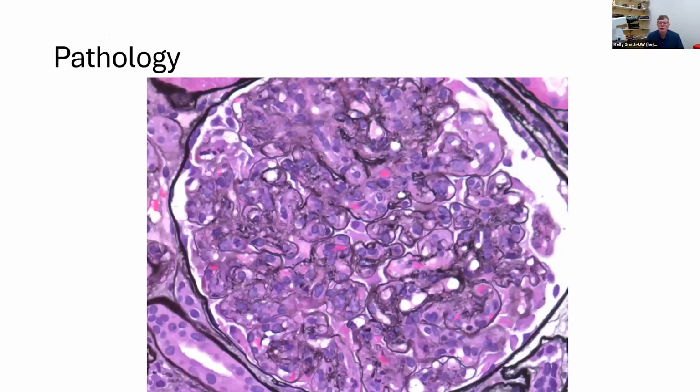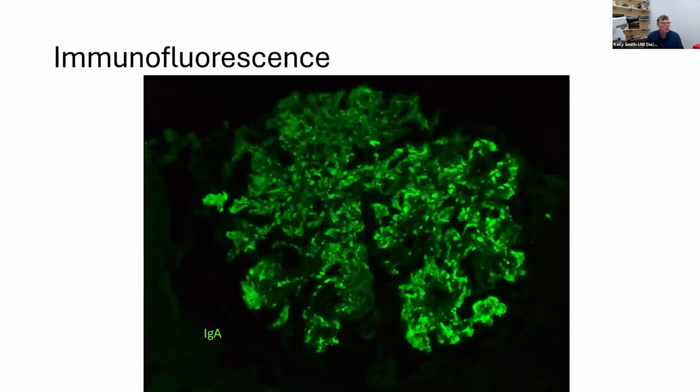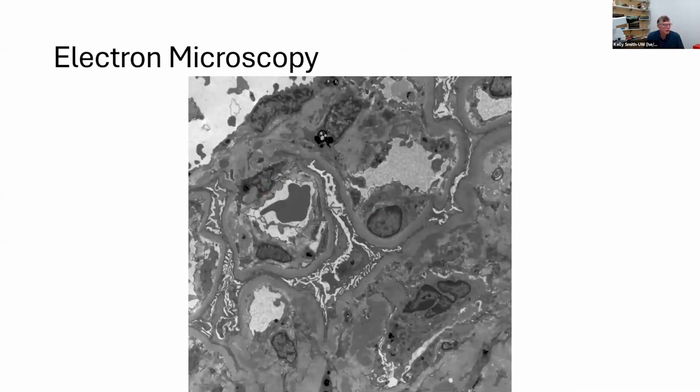And this is the biopsy, and this is a hypercellular biopsy. There are a few neutrophils present, but there's a lot of mononuclear inflammatory cells, not a lot of remodeling, but we do see maybe some eosinophilic material present. It's mostly hypercellular, a little bit more of a membranoproliferative pattern without a lot of remodeling. Immunofluorescence shows IgA, so this is an IgA-dominant immune complex-mediated glomerulonephritis.